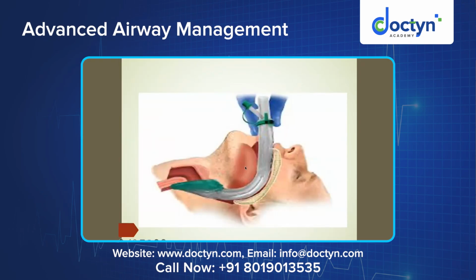You could see this. So this is the laryngeal mask airway inside the oral cavity. So this is the mask which I'm telling now, the mask sitting over the vocal cords. The one behind is the esophagus. This is the trachea. So here will be the vocal cords, just below the epiglottis, and this will deliver the ventilation. So this is a firm tubing through which this connector will allow connection to the ambu directly or to any circuit which will allow ventilation. These are the parts.